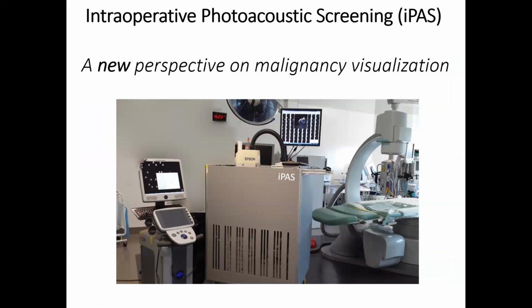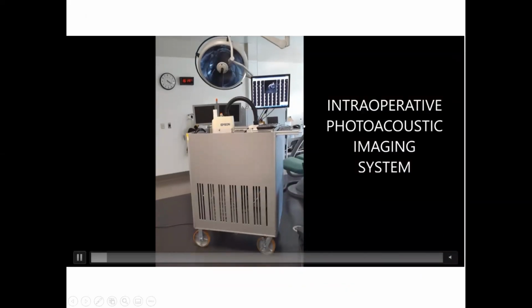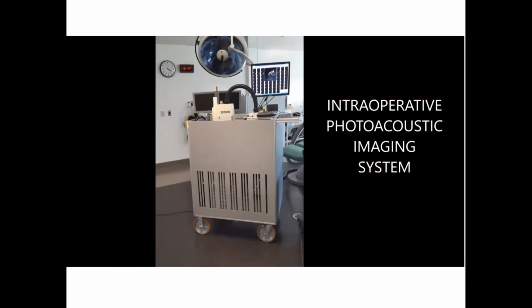And this brings me to the objective of our work. This was to evaluate a new imaging modality called Intraoperative Photoacoustic Screening, or iPAS, for the potential of effectiveness in evaluating breast cancer lesions intraoperatively. So the following video demonstrates our intraoperative imaging protocol.